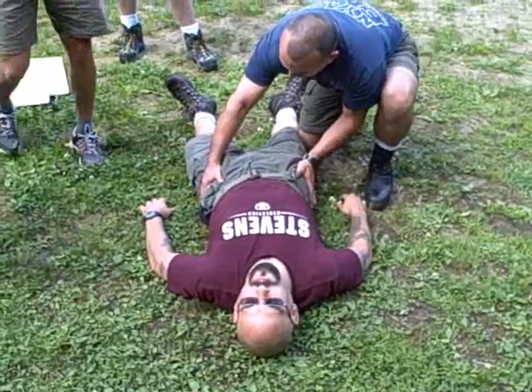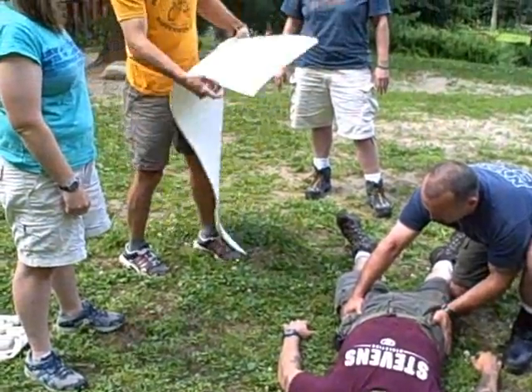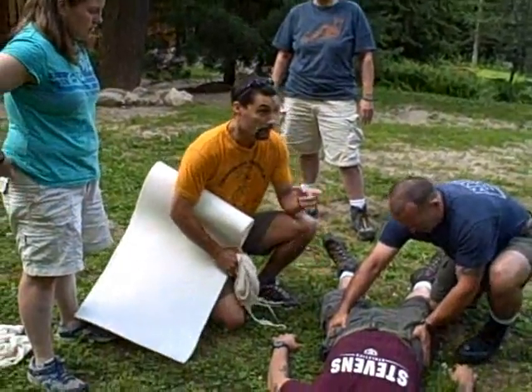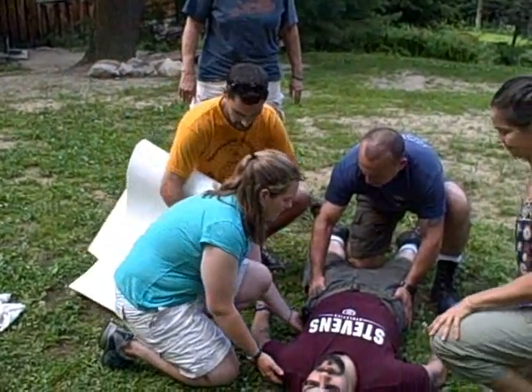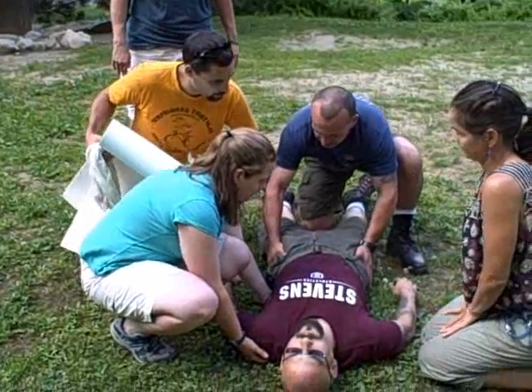Now Ivan's going to hold that tight while Sean comes in. Ivan, I'm going to have you hold the pelvis stable. We're going to get a couple more people to come in and lift him off the ground so we can slide this pad underneath in order to stabilize that pelvis.